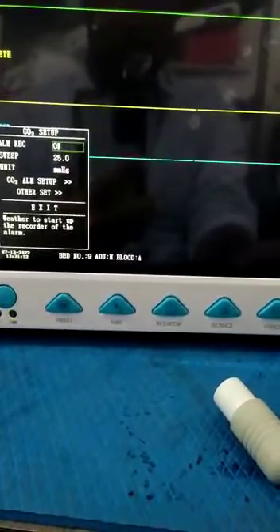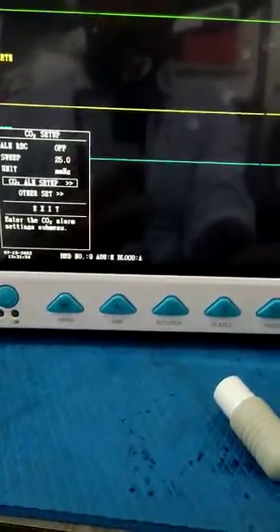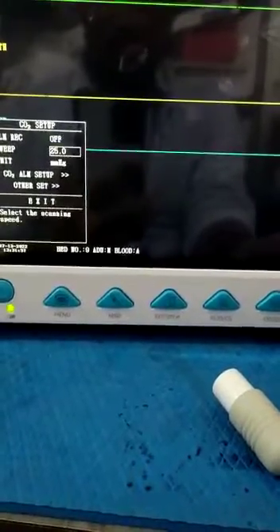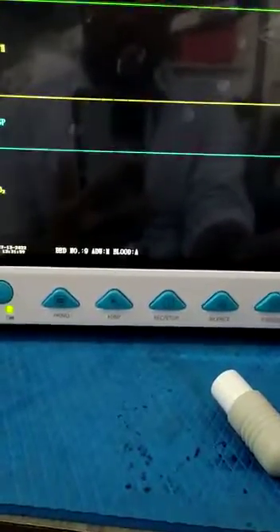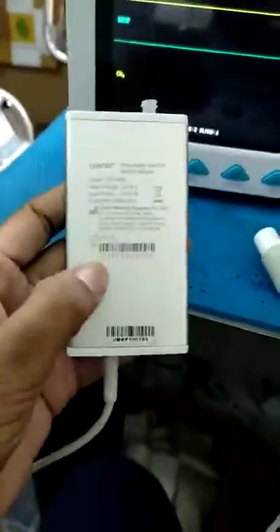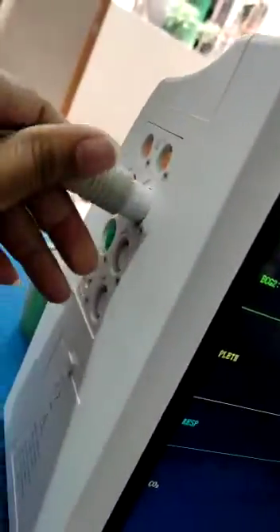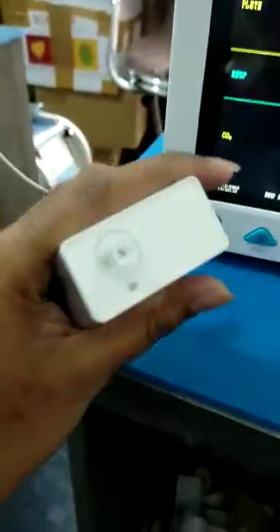Exit the settings. This is the EtCO2 module — you can see it here. We have to connect it at this port. Once connected, it has already started working. You can see I am closing this circuit and it is giving some value.